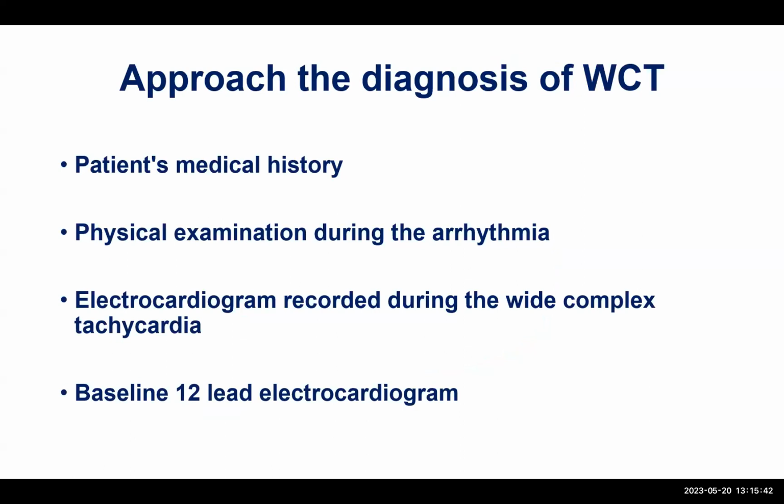How to approach a patient with wide QRS complex tachycardia? First, start with medical history. Then physical examination in the emergency room. There are certain things that can shift you to think about VTAC or supraventricular tachycardia with aberrancy or other differential diagnosis. Analyze the ECG during the tachycardia.